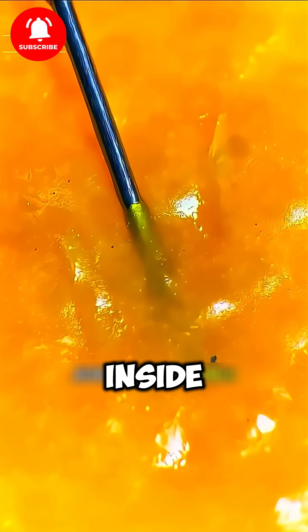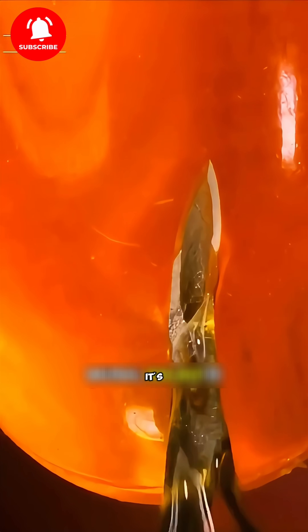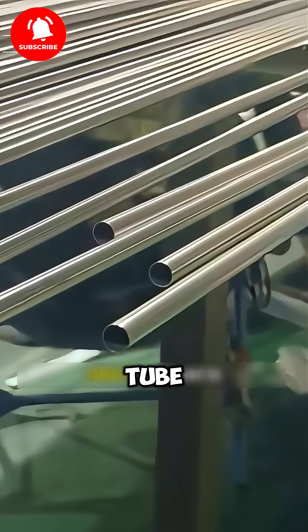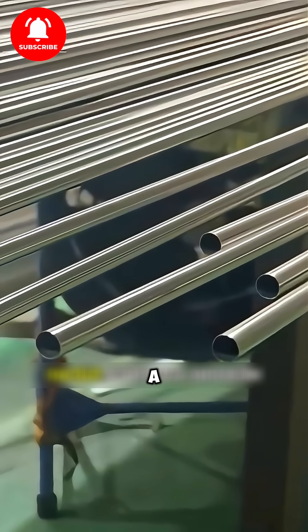Why is there such a tiny hole inside a syringe needle? Well, it's not drilled in. The needle is actually made from a metal tube, or cup, that already has a hollow center.